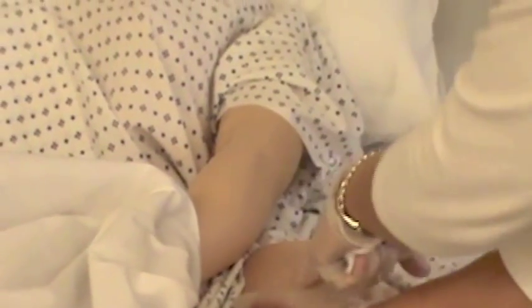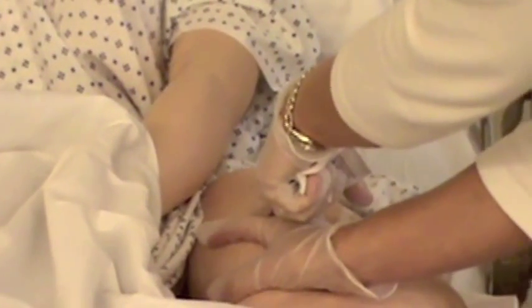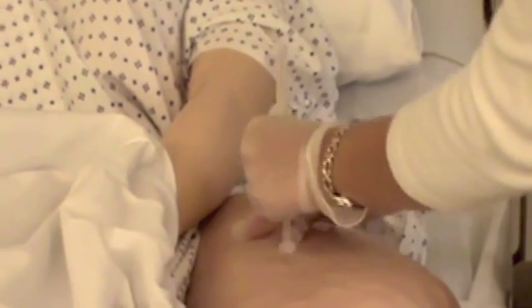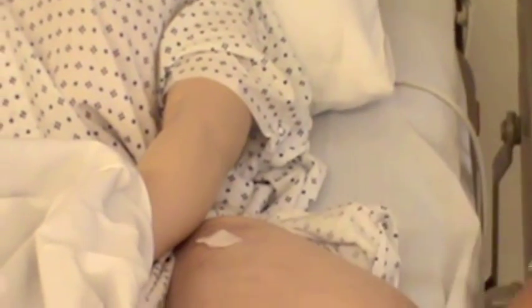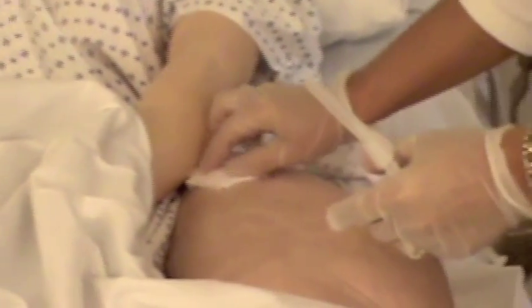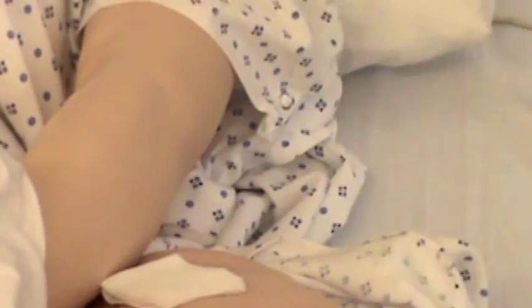And in this V is where I am going to be doing my injection. Okay? So I'm going to take my alcohol wipe and clean that area. And then I'm going to leave that alcohol wipe just to point, and I'll replace it with my 2x2 so I have that pointing right to where my injection site is going to be.